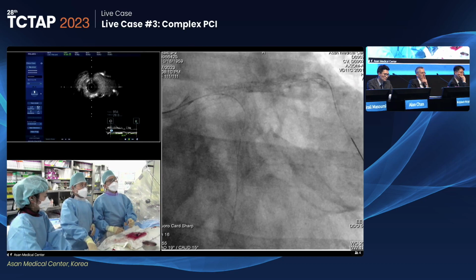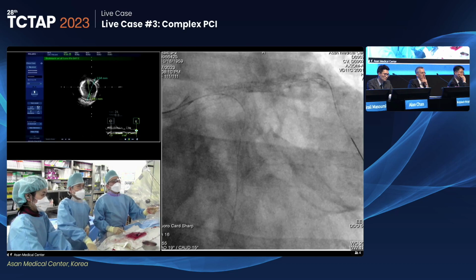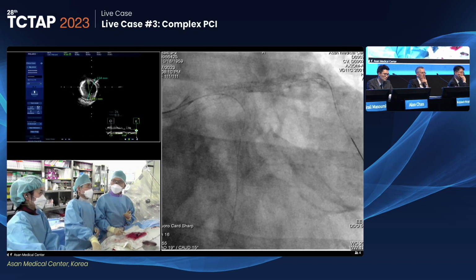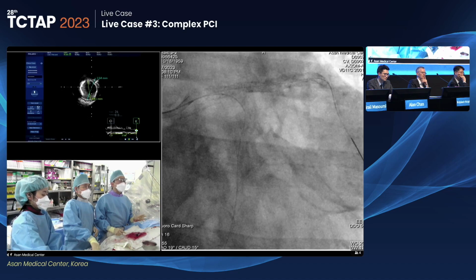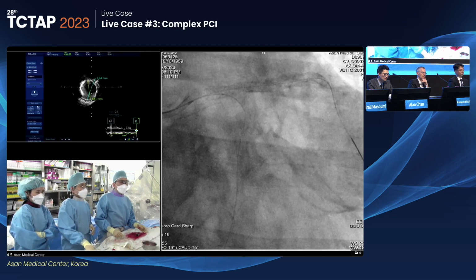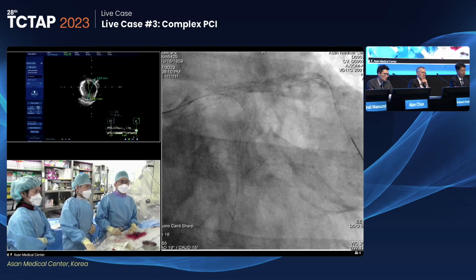The length from the distal landing to circumflex ostium is 28, so I will use the 28 stent. I confirm that the distal region has calcium break, and in the proximal region, there's a mass effect of the calcium. With the balloon, I cannot further dilate, I think. I will implant the stent and consider further dilating with the big NC balloons.